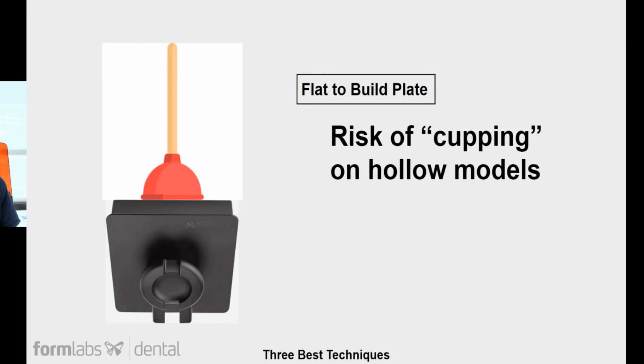It gets stuck when it's printing, and when the build plate lifts off, it pops up and can delaminate layers, so you can start to see layers getting off registration, or your Z height can be inaccurate because it's peeling and then maybe it doesn't go down, or it sort of leaves air because it's ripped off the part. It's just a bad situation, and sometimes you can't even tell, which is even worse.